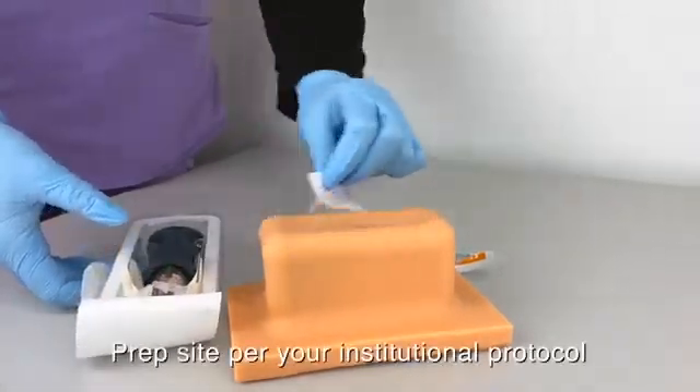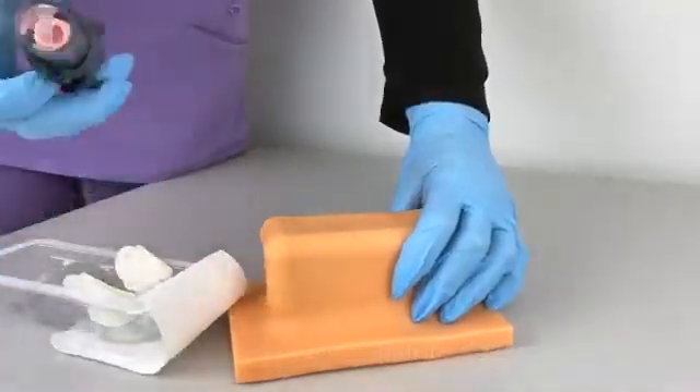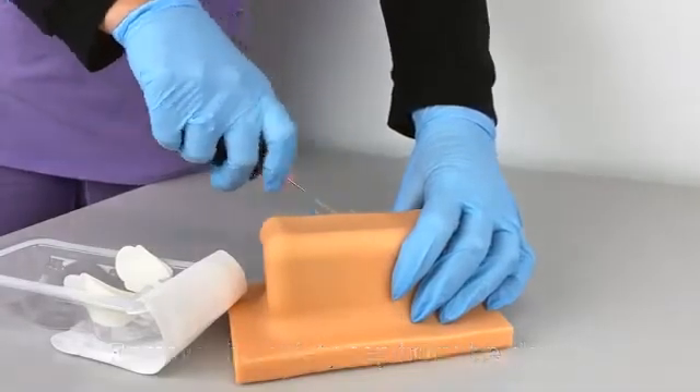Once you have located the landmark, clean per institutional protocol. Maintain stabilization of the limb throughout the entire procedure. Remove the safety cap and grasp the NEO device.